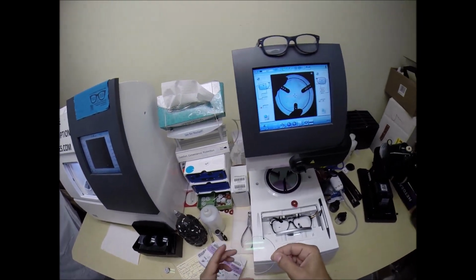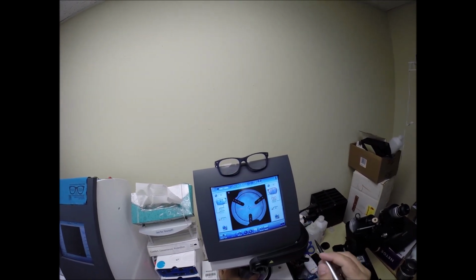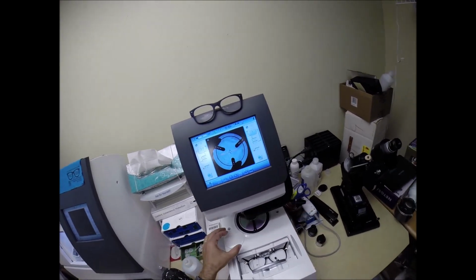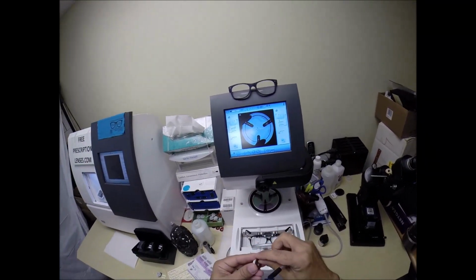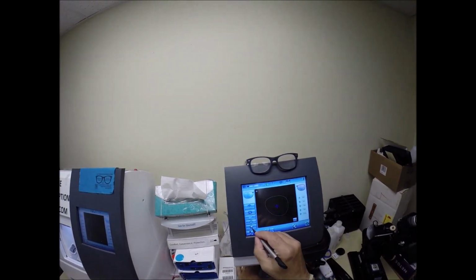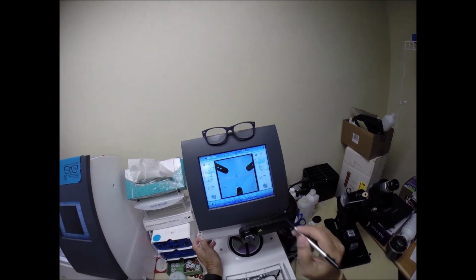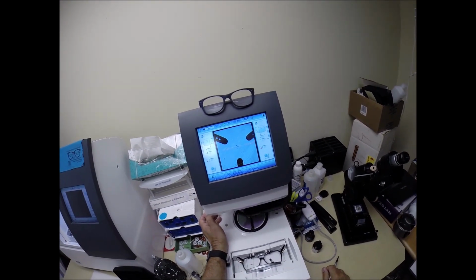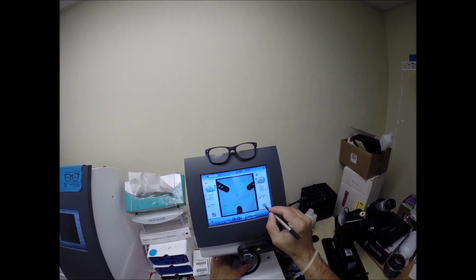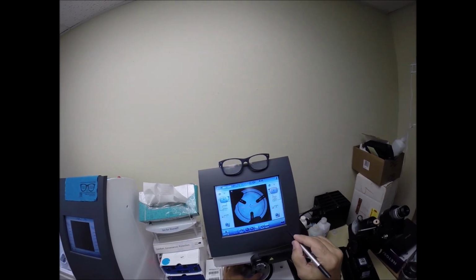Do the same thing now for the left. Make sure it is centered in there. Hit the button, up, got ahead of myself, look at that. Pull the paper away to make the black side sticky. I got to put the block on there. Pull the shape back up. And just because it likes doing two lenses at a time, let's go ahead and do the right lens again. You can pretend to do the right lens. Now we'll do the left lens. Just want to make sure it is centered. There we go.